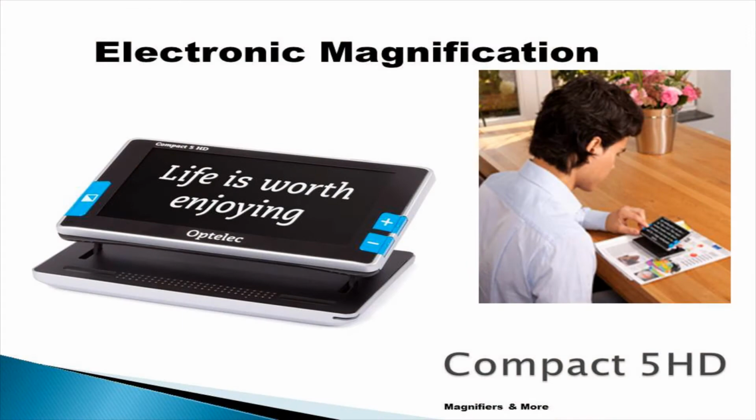And this is another new gizmo gadget that has come out, and this one is called the Compact 5. Same principle. We have a camera in there that you can change. So with the push of a button, I'm going to change the magnification. And I'm going to go from 1.5 times magnification to 18 times magnification. This kind of sits on the paper and it glides across the paper.